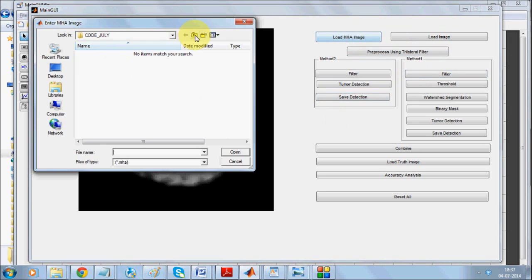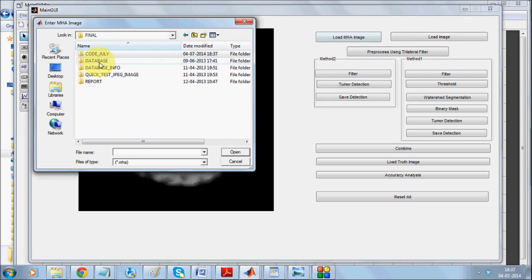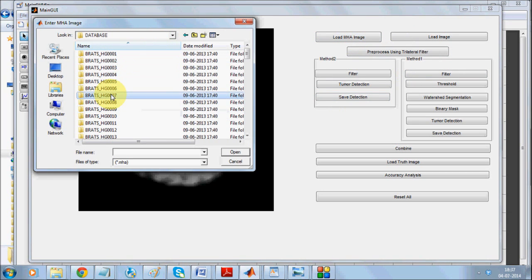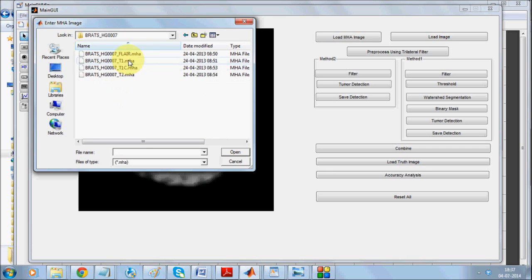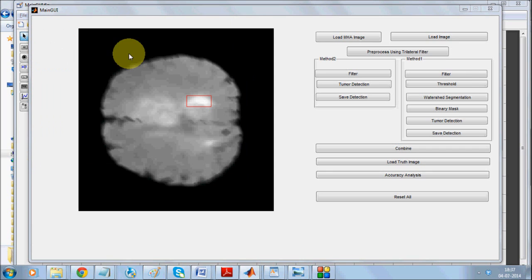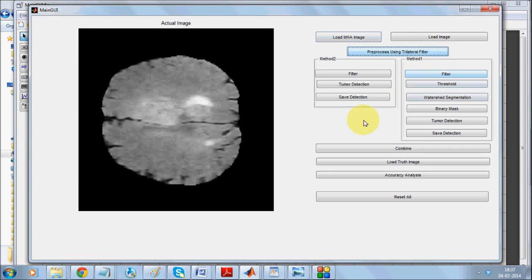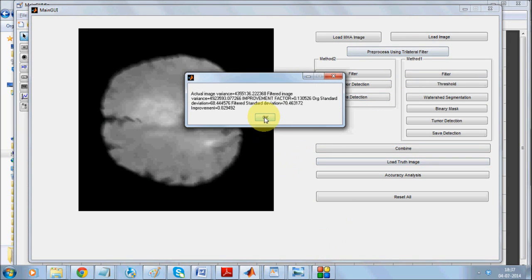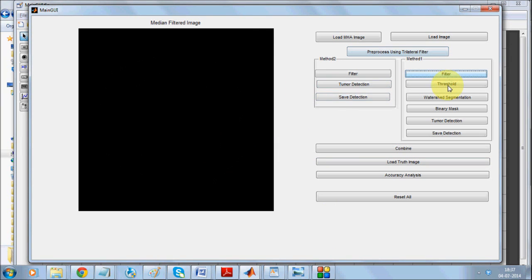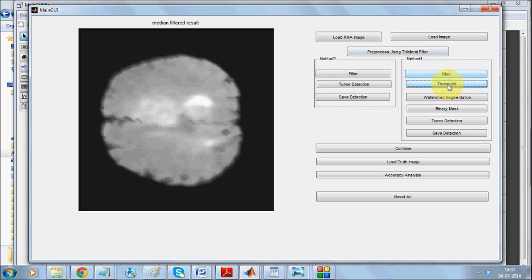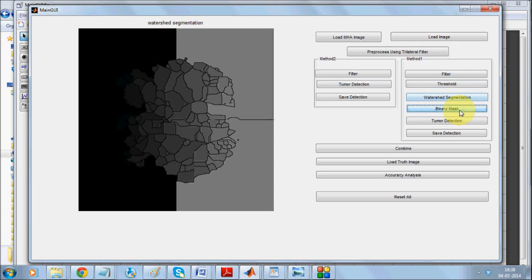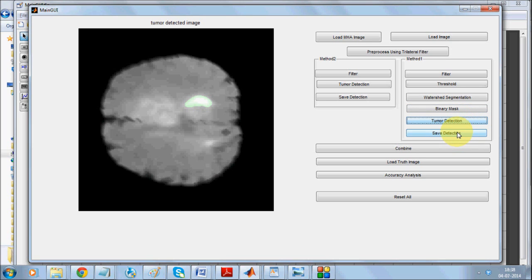Again we have to load the seventh image. Apply median filter, put some threshold, use watershed segmentation, mask, apply mask, call for tumor detection and save the detection.